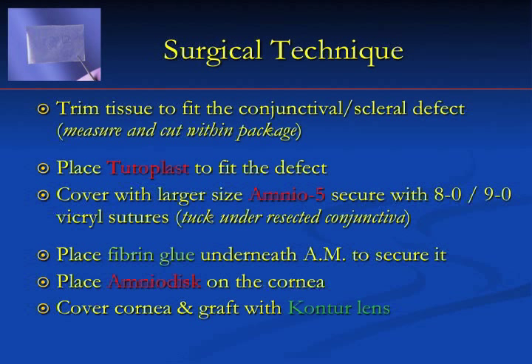The reason is because it had such a large diameter, 18 millimeters, it did not cover only the cornea itself and the area of involvement, but beyond that. So everything that we put before was secure in place, and her blinking was very easy and comfortable afterwards.